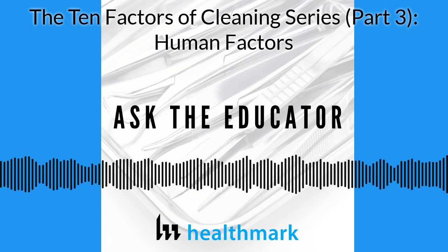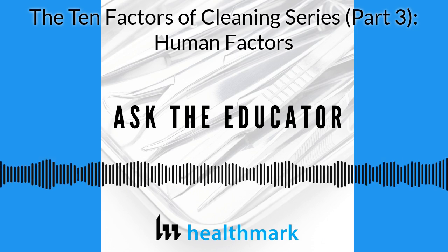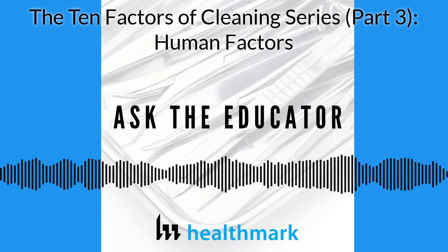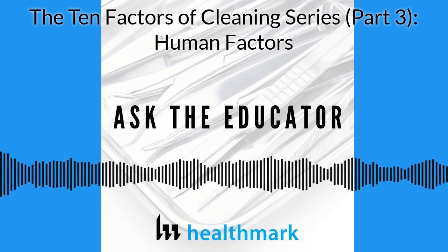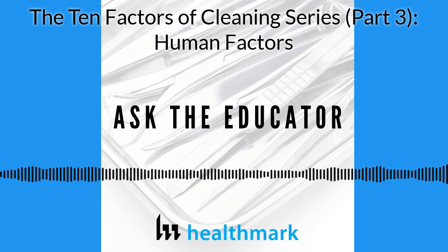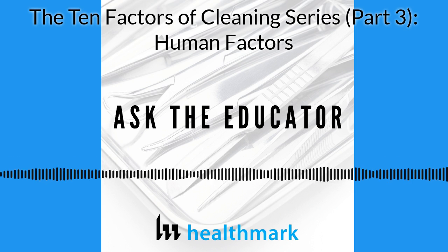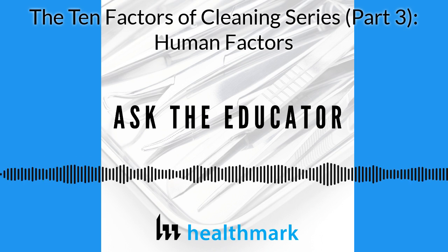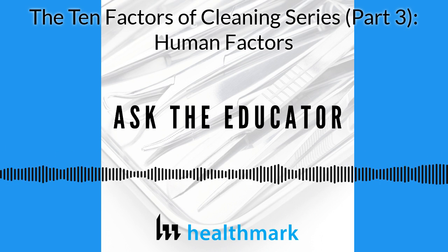Well, number one, yeah, it does remind me of just a very common problem, but I'm glad that you brought up not only training, but human factors as a whole, because I think sometimes that issue is training. And I think sometimes it's also the human factor of wanting to rush and get things done. Because say a vendor tray comes in and people look at it and they think, well, it's already been cleaned. I can just throw this in the washer and move on with my day to the other instruments that are clearly much more dirty, without taking the tray apart and all that stuff.